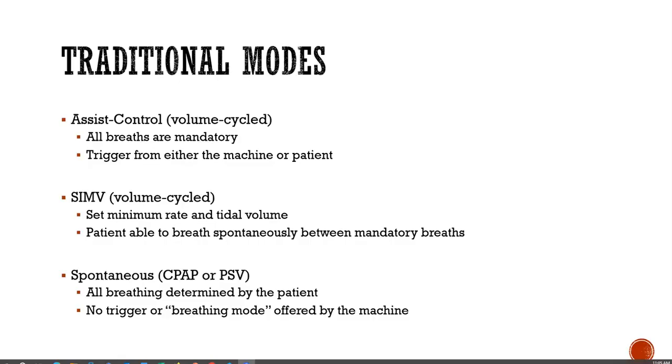And then we have spontaneous, which is CPAP or PSV. I really have only ever heard it called CPAP. So all breathing is determined by the patient, and there's no trigger or breathing mode offered by the vent. So this is where we do a CPAP trial. We use this to determine if the patient is able to be extubated.